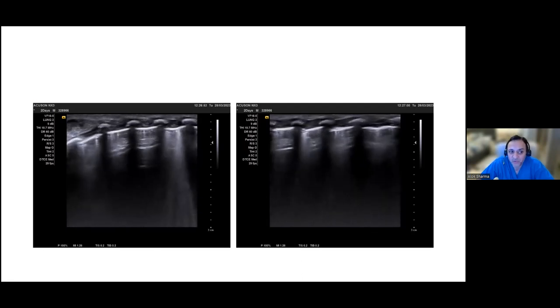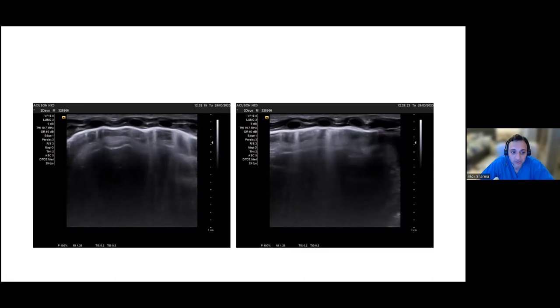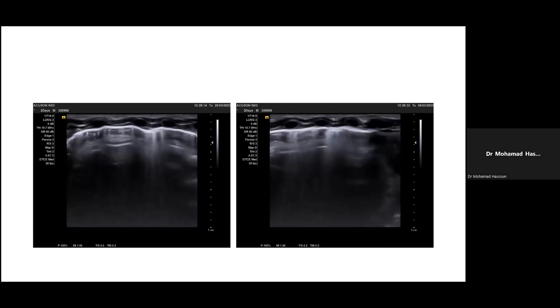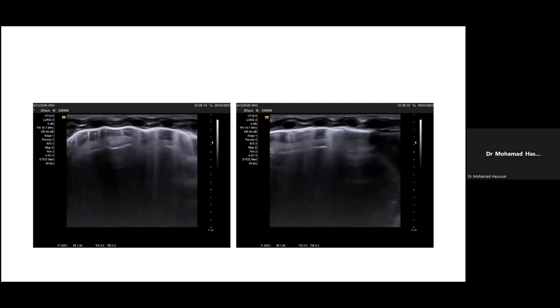Ideally, by definition, what we really need is some pleural abnormality for us to say it's a consolidation. But I think your images are very nice, very good quality. This is beautiful depth. So can you see the 3 centimeters? Your gain settings here are perfect. I'd say that these images are beautiful. There's nothing that I could say to get them better.